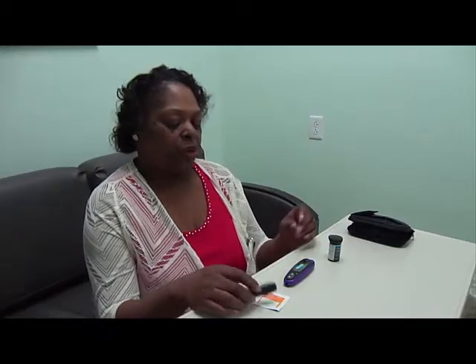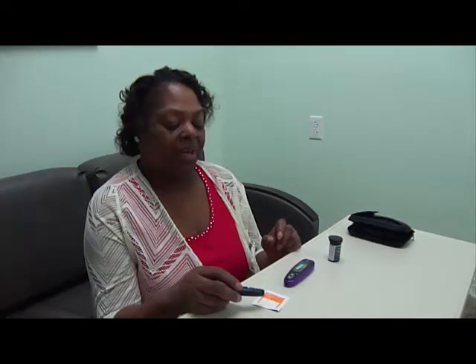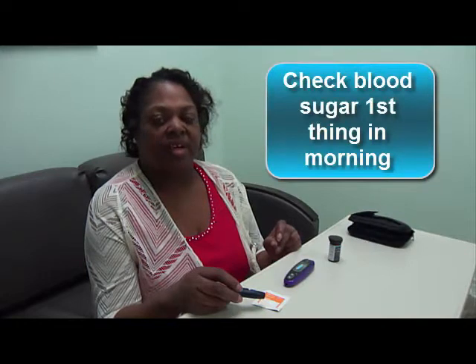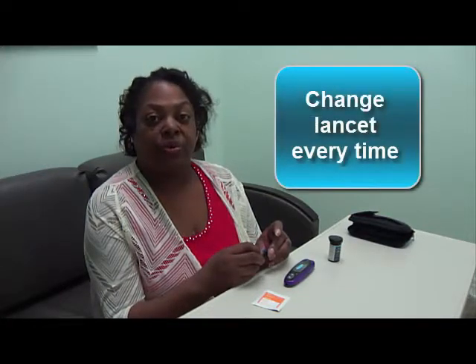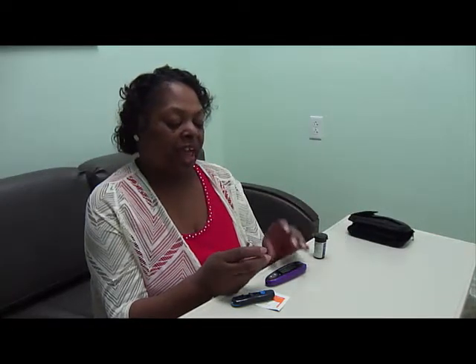Okay, I'm going to go through what I do as preparation for my morning. The first thing I do before I get up is check my sugars about 6:30, 7 o'clock in the morning. I have my lancet and my trigger for my lancets, and I change it out every time I get ready to do a different reading. I have my strip. So I check the expiration date, make sure we're not expired for that.